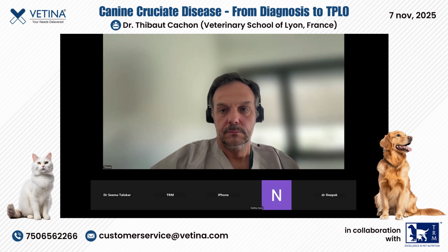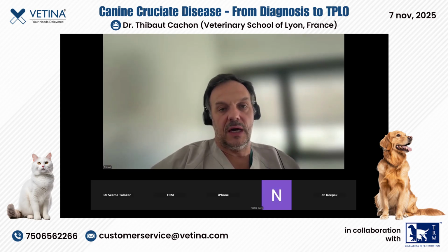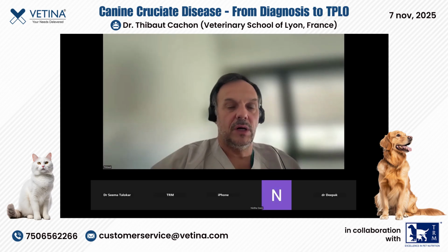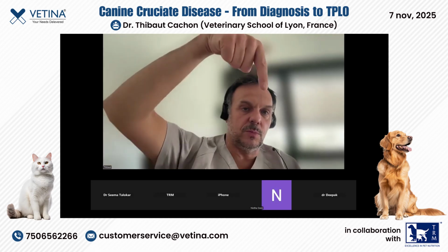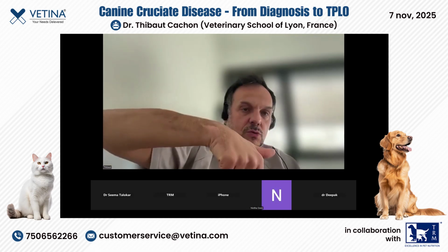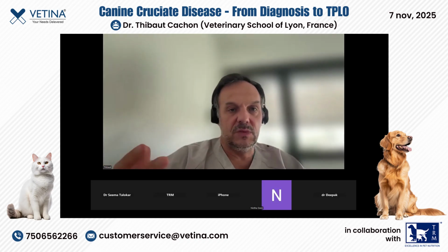Aligning to this, there is one more question. How would you position the patient during the TPLO surgery? Usually, I put the patient in dorsal recumbency to do my arthroscopy, and currently I keep the dog in dorsal recumbency to do the cut, but you can also move the dog into lateral position to get the cut more perpendicular to the table. It depends on your preference.